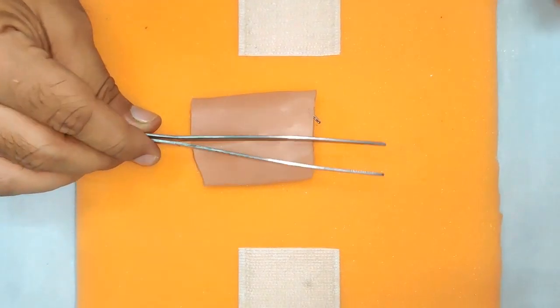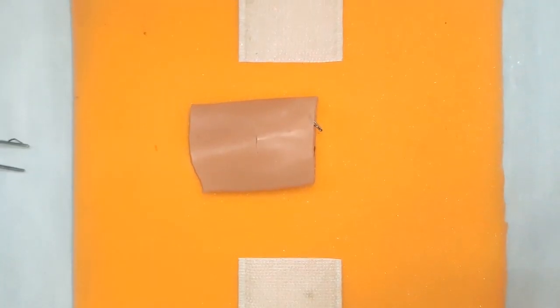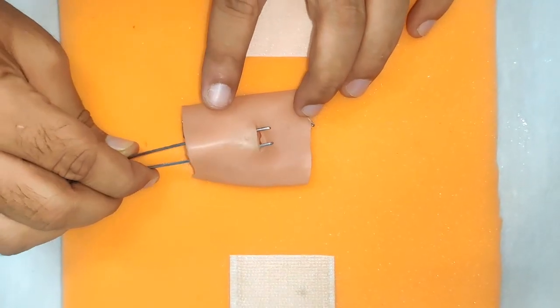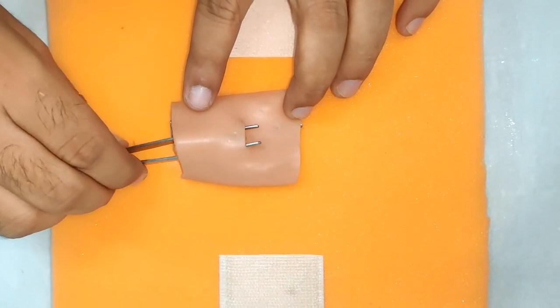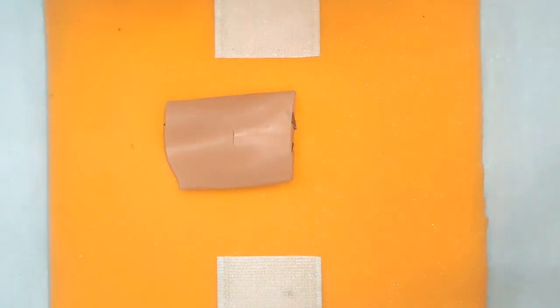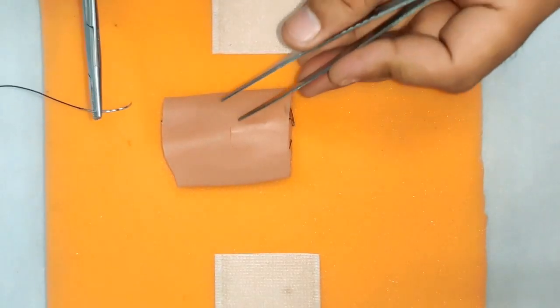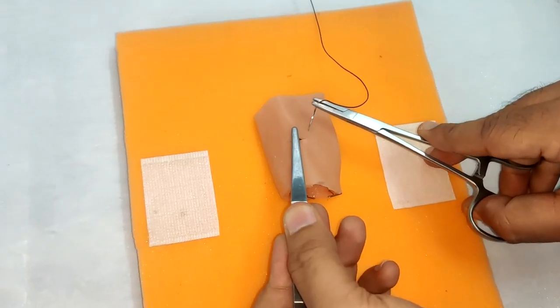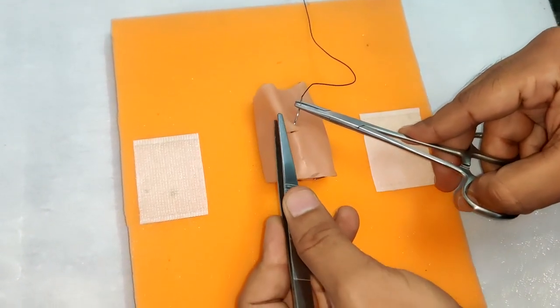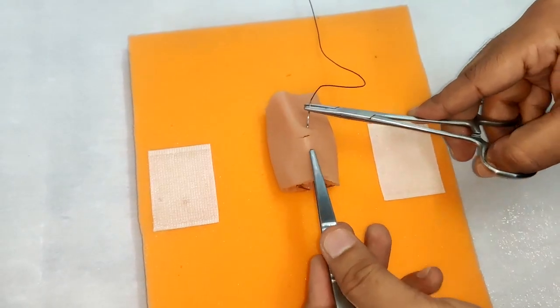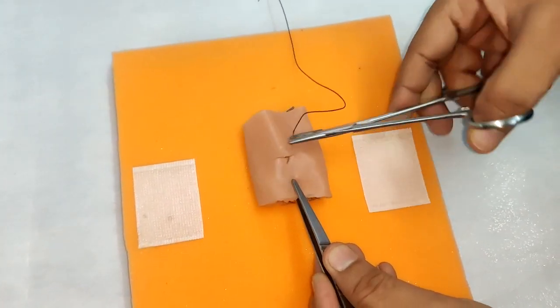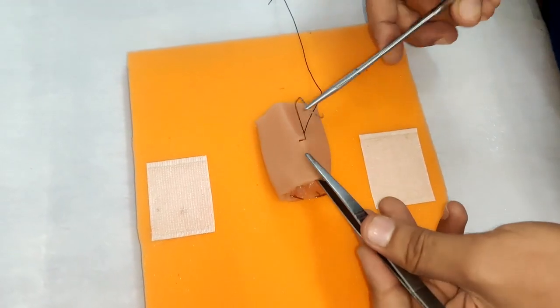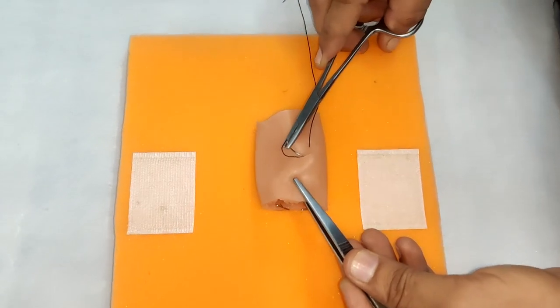This is the second technique to close the perforation. This is the axis of your bowel and again we will be suturing perpendicular to it. The perforation is approximately 1 cm in size. Again we will start from beyond and come out from the center, and again we will go beyond and come out.